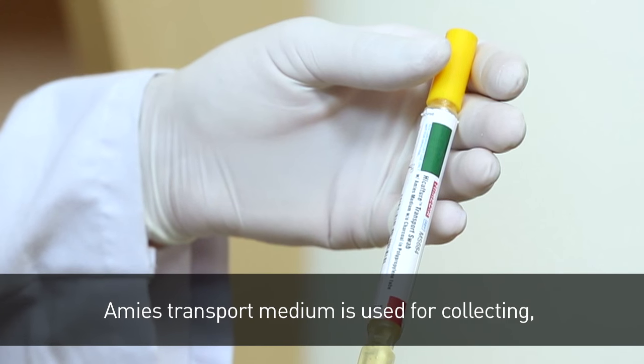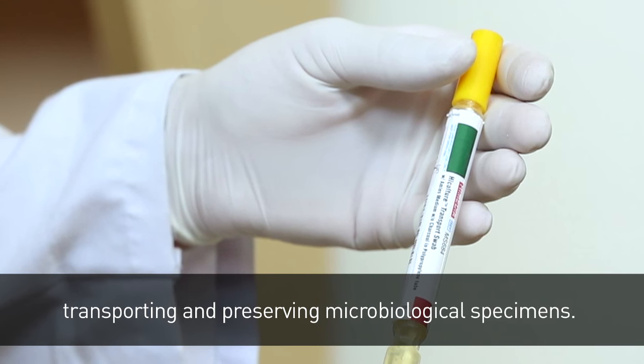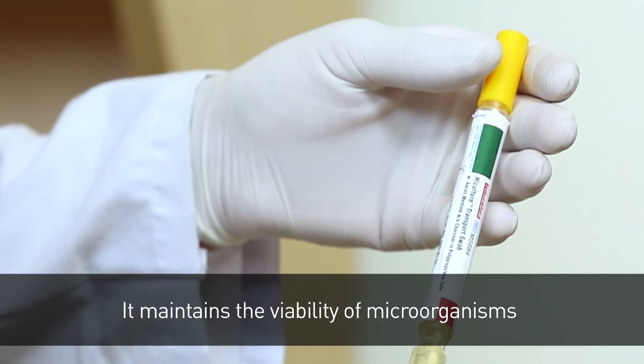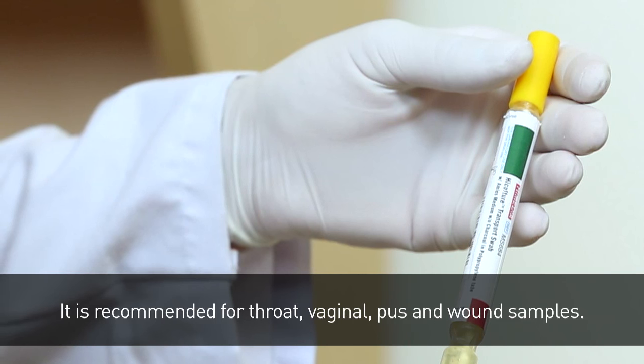Amies transport medium is used for collecting, transporting and preserving microbiological specimens. It maintains the viability of microorganisms without significant increase in growth. It is recommended for throat, vaginal, pus and wound samples.